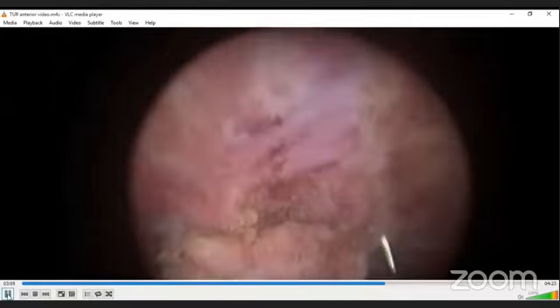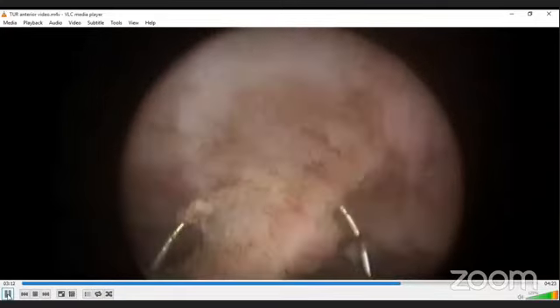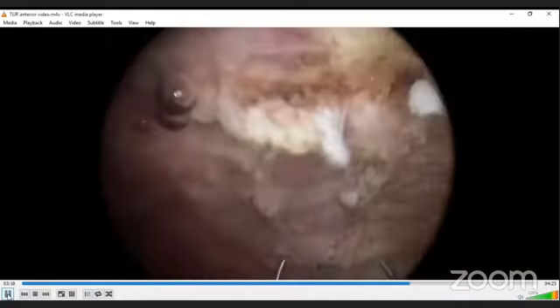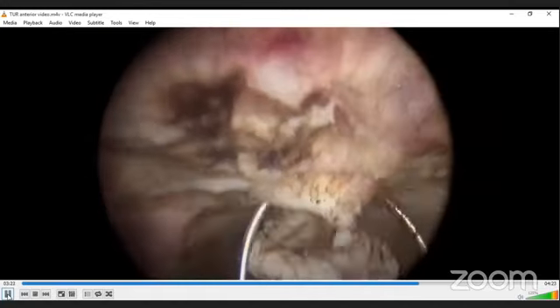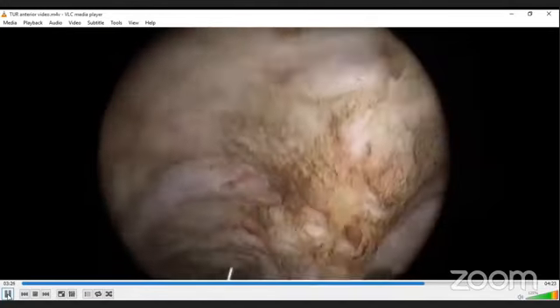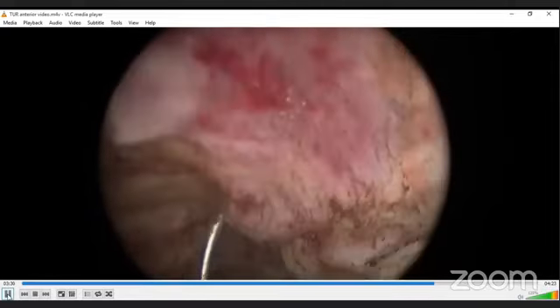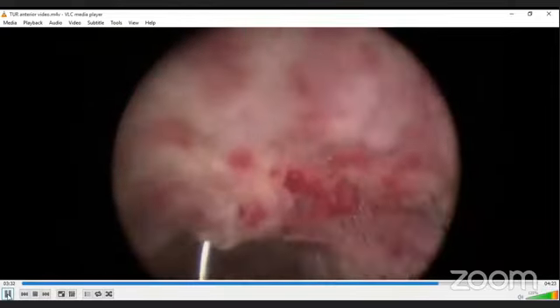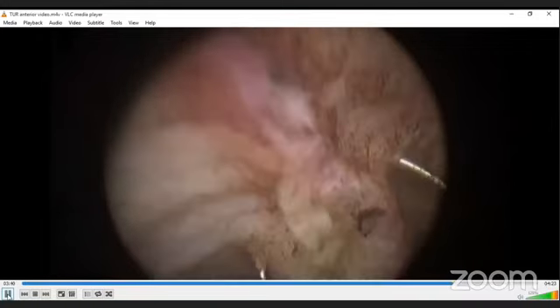And as you see, we are going deeper in this case in the tumor. There are some muscle fibers which are seen. And once the tumor is cut, the deep tissue or the muscle is to be excised. There you can see nicely the muscle fibers, and this would be obviously sent separately. Ideally, for the whole base of the tumor, this kind of deep resection is to be done. It is most ideal. Some people even describe it as a near perforation kind of a resection, which may be needed.